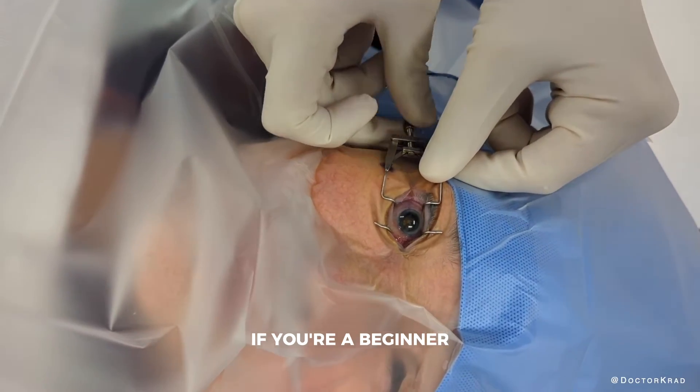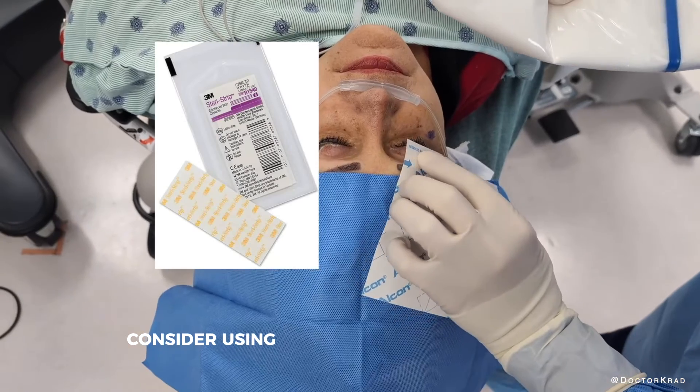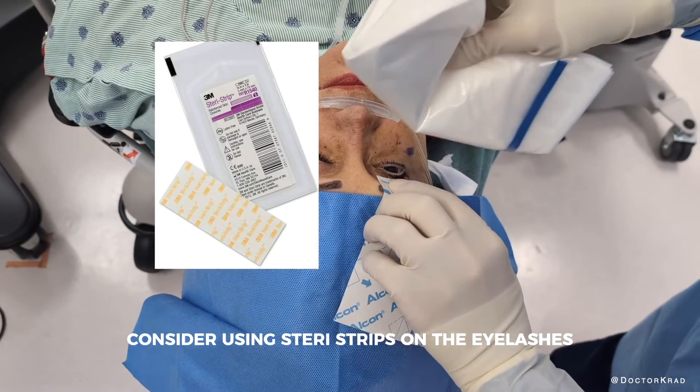If you're a beginner or you have a very difficult patient to drape, consider using Steri-Strips on the eyelashes prior to draping.